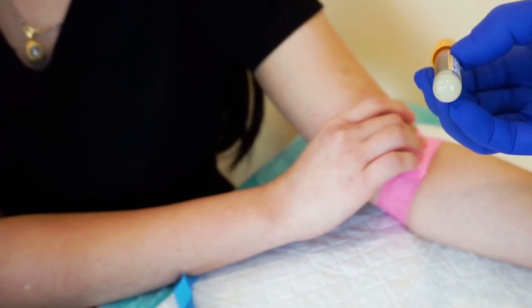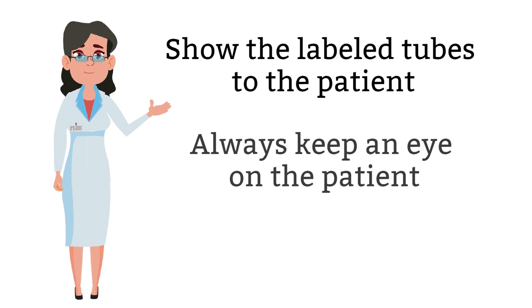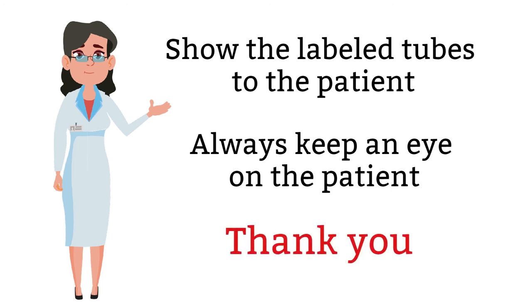As soon as you are done labeling the tube, let the patient take a look and verify that the information is correct. While you are doing this, you will also keep an eye on the patient, making sure that the patient is doing okay and not fainting. Eighteen, you then thank the patient for his or her cooperation and exit or let the patient go.